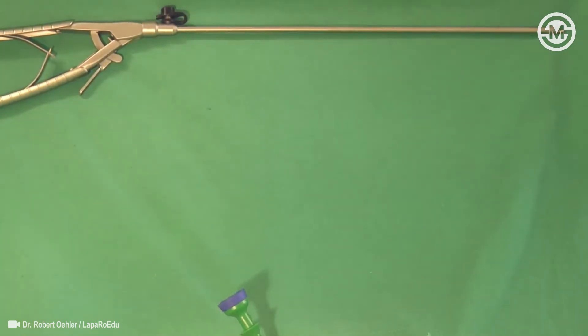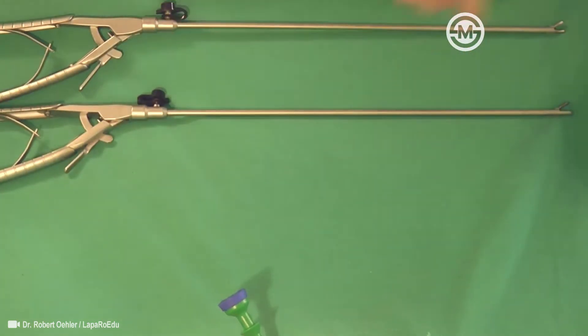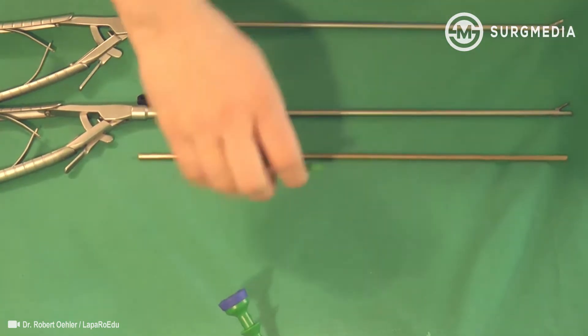This video demonstrates a simple method for laparoscopic vaginal cuff closure after hysterectomy. A pelvic trainer with a fixed camera is used.